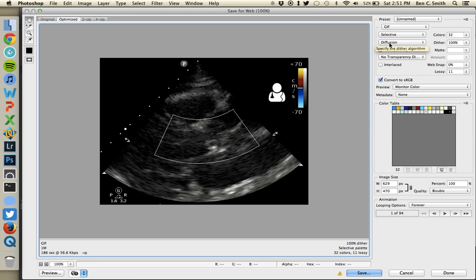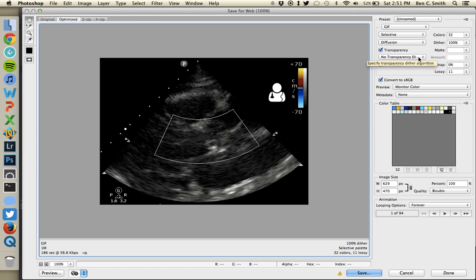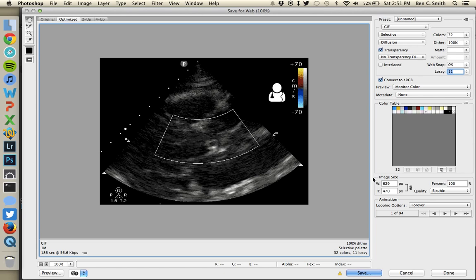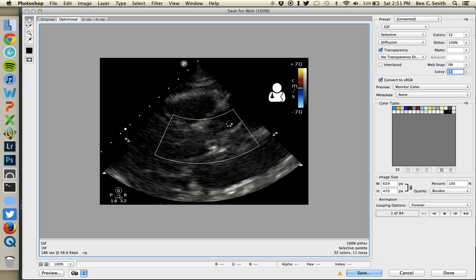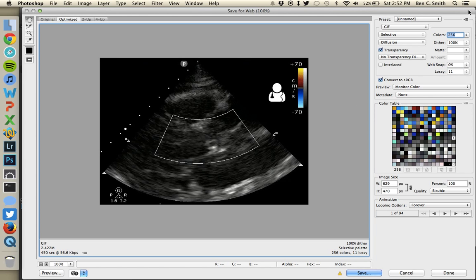Usually I keep the color reduction algorithm on Selective and dithering on Diffusion. You can leave Transparency and No Transparency Dithering selected. The most important settings that dramatically alter file size are: lossiness, number of colors, and image size. Since this ultrasound has color in it, you're going to want to go with 256 colors — for a black and white image you could use 32 or 64. Jumping to 256 colors put my file size up to 2.4 megabytes, so I'll need to adjust other settings to bring it down.